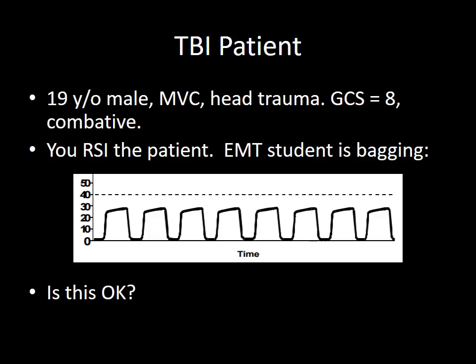This is not okay. Remember that with head trauma, we do not routinely hyperventilate our patients, and this is what's going on. The student, for whatever reason, maybe a little excited, is bagging a little too aggressively. I would be too. The EMT student is just bagging too fast, so we really need to hold off and let that carbon dioxide build back up and maintain the end tidal between 35 and 45.